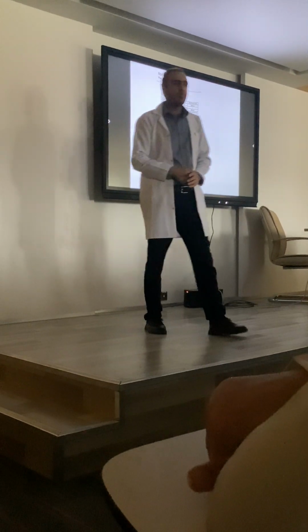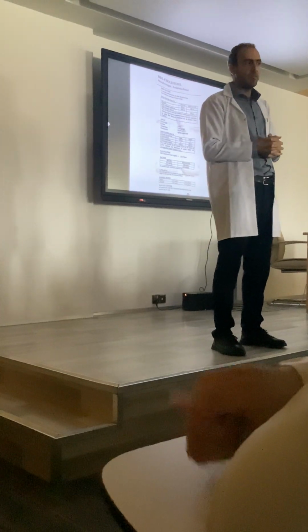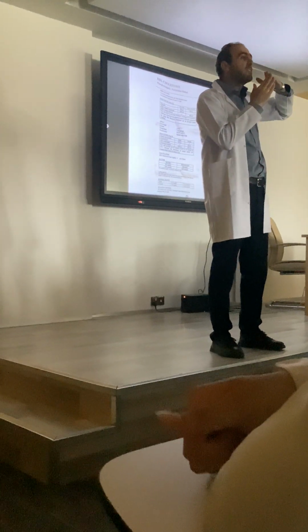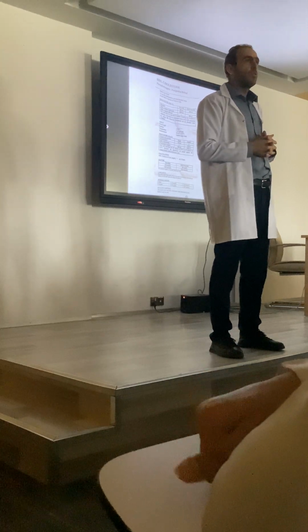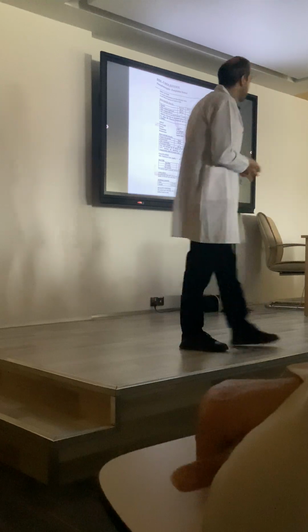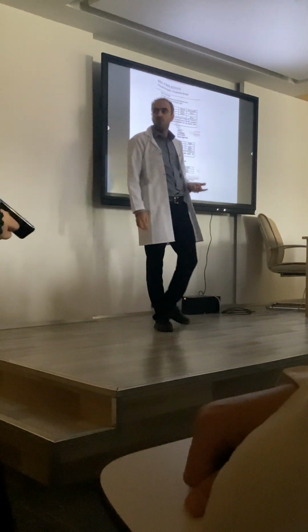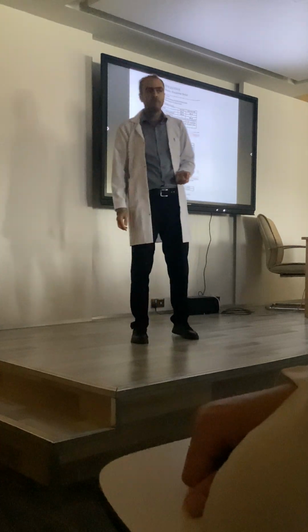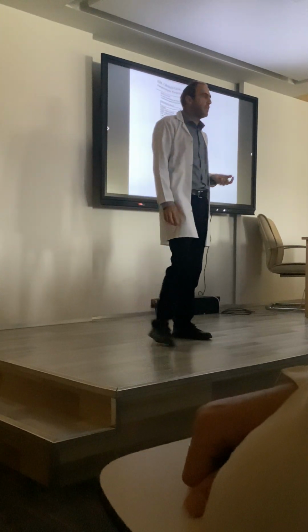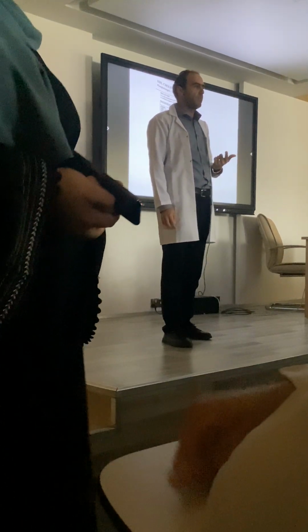Also, if you were in the lab and you did this test by yourself, if the concentration of cholesterol was more than 200, because it's out of linearity, you need to dilute the sample.